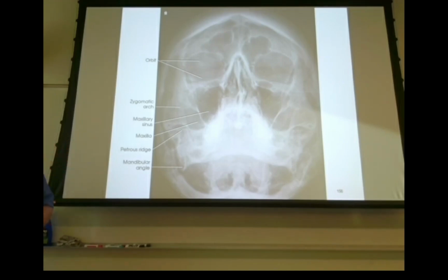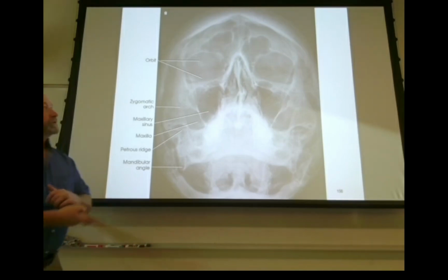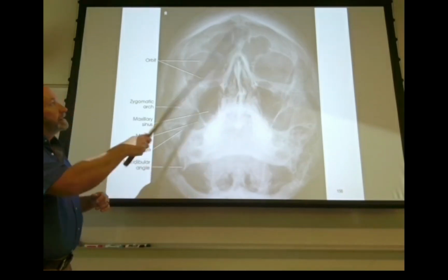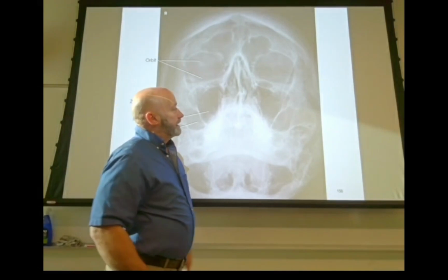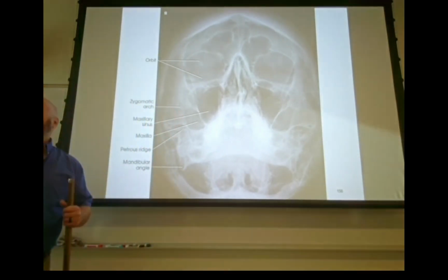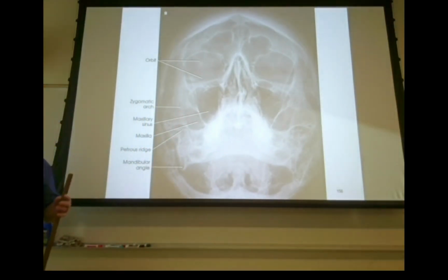Waters, and lateral, in my opinion, are really the only three views of the skull we ought to be shooting. That's just my opinion. Because you can see all sinuses, you can see skull fractures, you can see some of your facial fractures. Like, okay, you lay on your back and you look up at the clouds and you see stuff, right? We walked through that when we were talking about the Scotty dog and L spine, right? Scotty dog, you kind of got to use a little imagination.